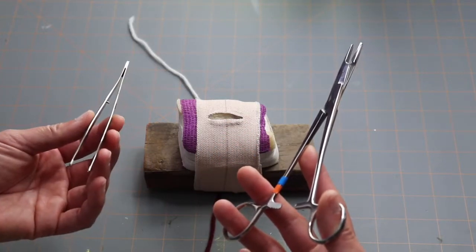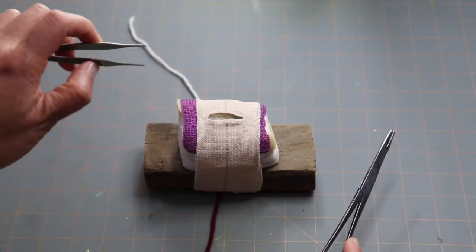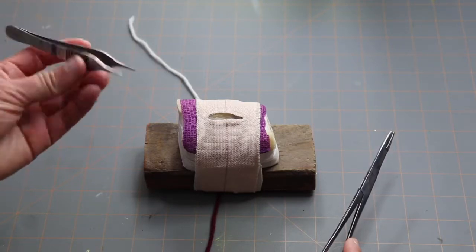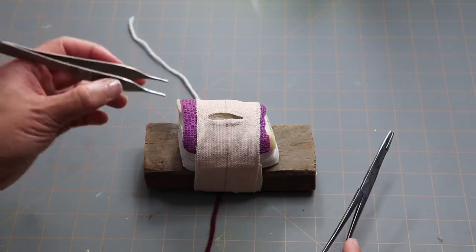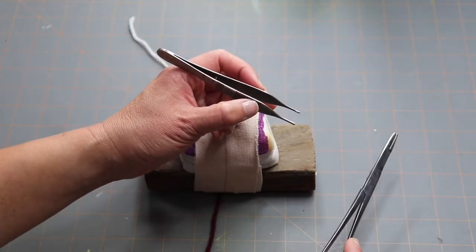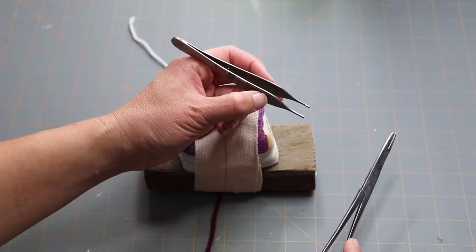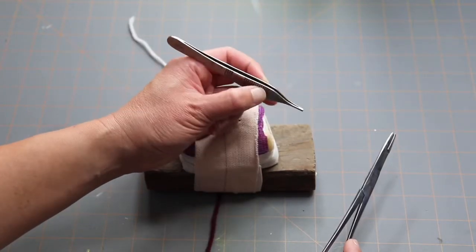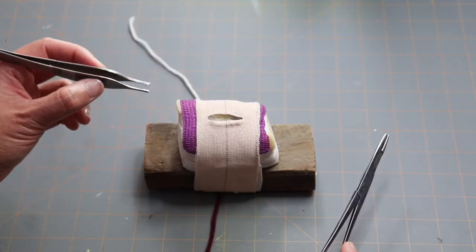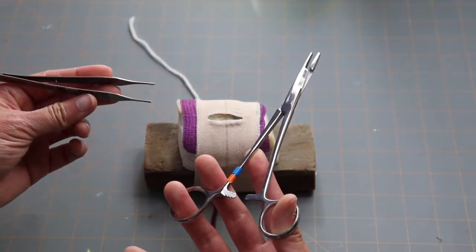Your thumb forceps you're going to hold like a pencil. Try not to overhand it — you might pinch too strongly and damage the tissue. If you hold it like a pencil you can be more gentle, and you can brace your hand against the patient or table to keep your hand steady as you're trying to pick up tissue. Holding it like a pencil gives you the most flexibility and control.